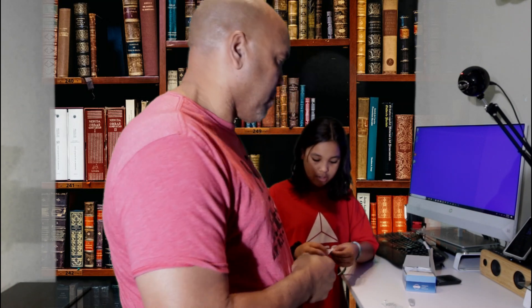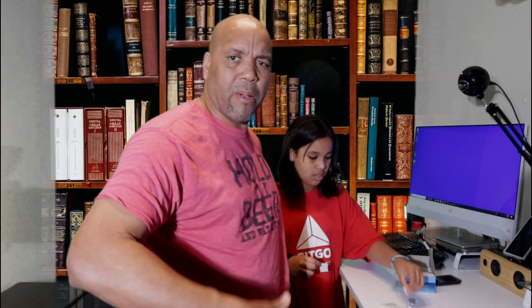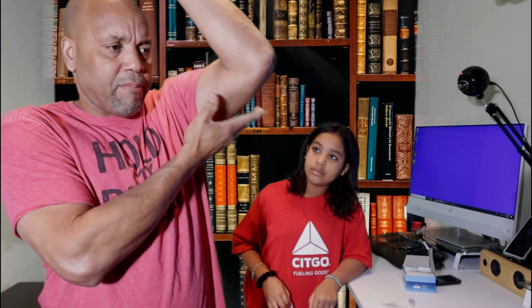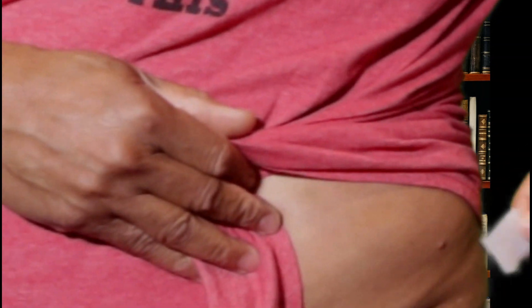I'm going to put it on my left side because it's easier for me to apply it myself, and I also sleep on my right side, so that's why I'm choosing the left. Some people put it under the arm, some put it at the back — it's up to you. For me, I'm going with right here, so she's going to clean it up.